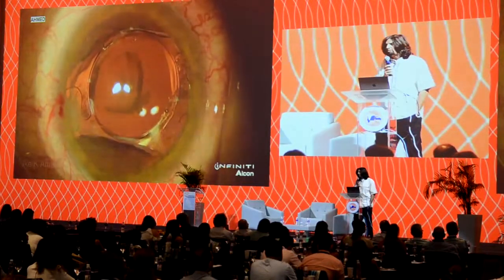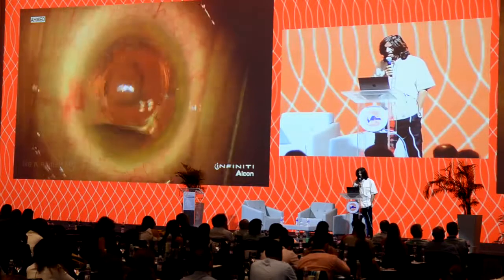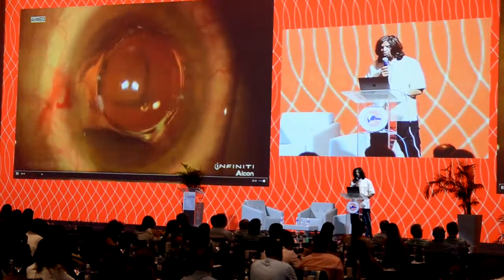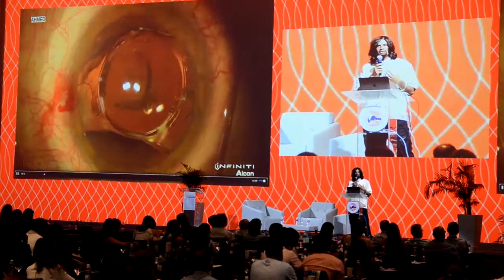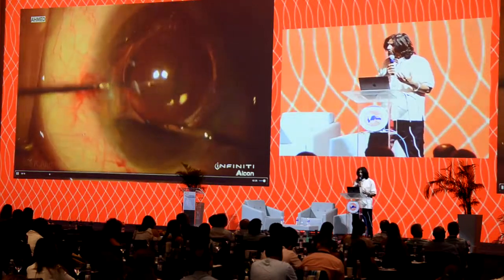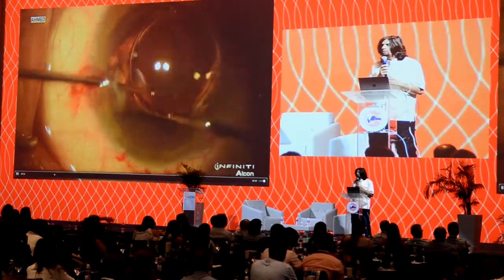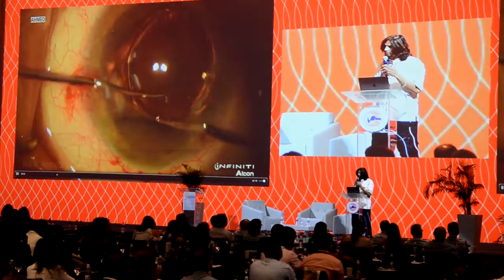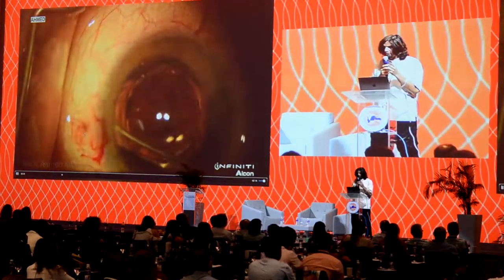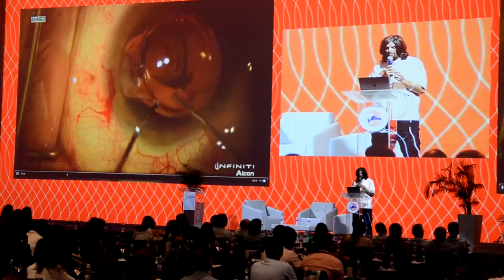And this is a modified plate lens done many years ago, and the patient had a capsulotomy done. You can see some Soemmering rings present. The goal here is to remove at least the optic and place a three-piece lens in the sulcus, maybe with optic capture. Again, even though it's 10 years later, we can typically lift off the IOL from the capsule itself using manual micrograspers and a Sinskey hook.